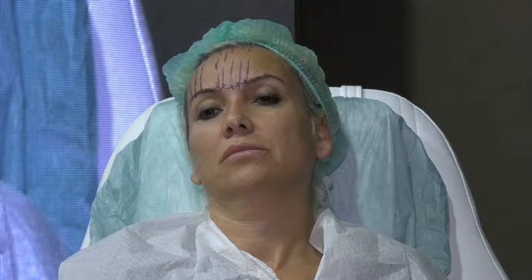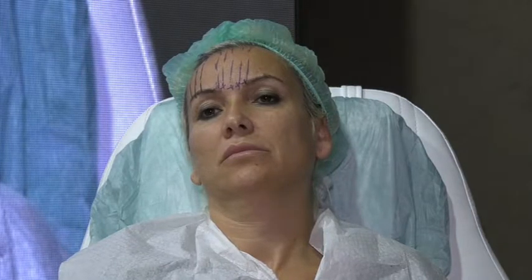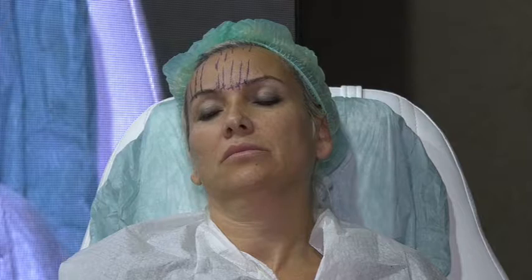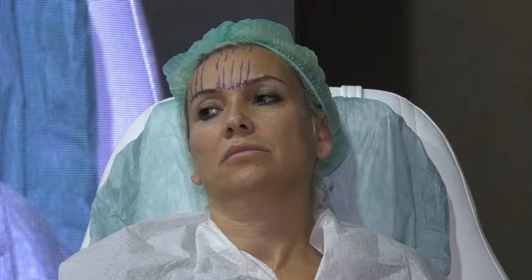Okay? What else can I do? For example, you have a patient with facial palsy. This eyebrow is like that. Do I also put only in the lateral third and leave the medial like that? No. You can put everywhere. You can put one here, one there, one here, one there, like 4 threads to try to lift the whole eyebrow. So, there are a lot of things you can do if you understand the concept. What I want, I will do. Which area I want to lift, I will put the thread on it.